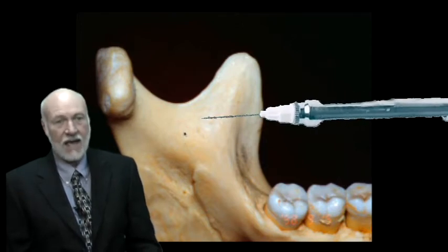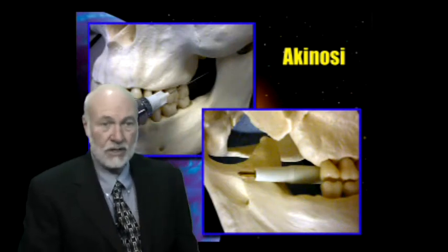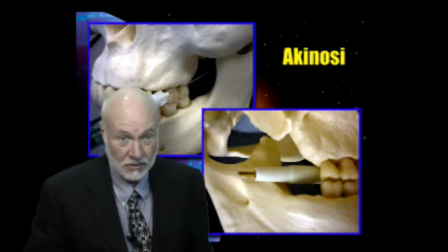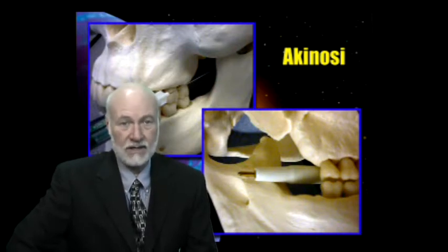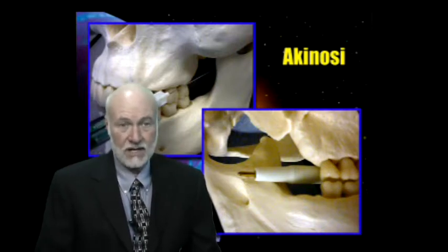Let's take a close look at the injection site. With the Akinosi injection, we're going to go pretty much parallel to the necks of the teeth, and we're going to go back about 2/3 of the way on the mandible. You can palpate the distance between the front and the back part of the mandible, which we call the ascending ramus, and then you'll go about 2/3 of the way down and inject. The problem with Akinosi, of course, is you don't have a bony stop like you would with the standard Halsted injection. However, even though this has a slightly lower success rate, it is a very valuable injection, and I think you're going to enjoy including this in your practice.